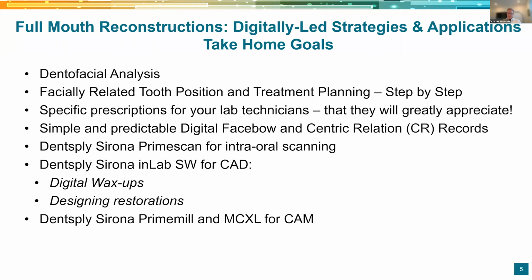Of course, we're using the Dentsply Sirona Prime Scan for intraoral scanning. And once we start getting into this next area, it's really about the design and the execution. For those of you that are doing it, you'll be using some software, whether it's the chairside software that you have in your system for the Prime Scan, that'll be the CEREC chairside. Otherwise, you can use other software. On this case, I happen to be using Dentsply Sirona's in-lab software. For me, it's a little more powerful. It allows me to work on a big screen at my design station.